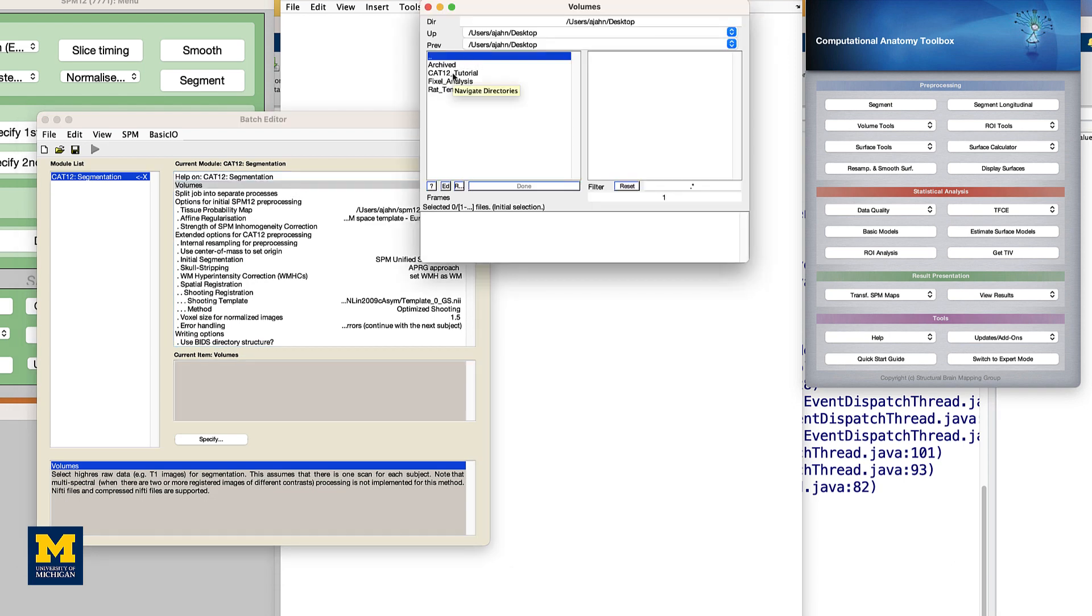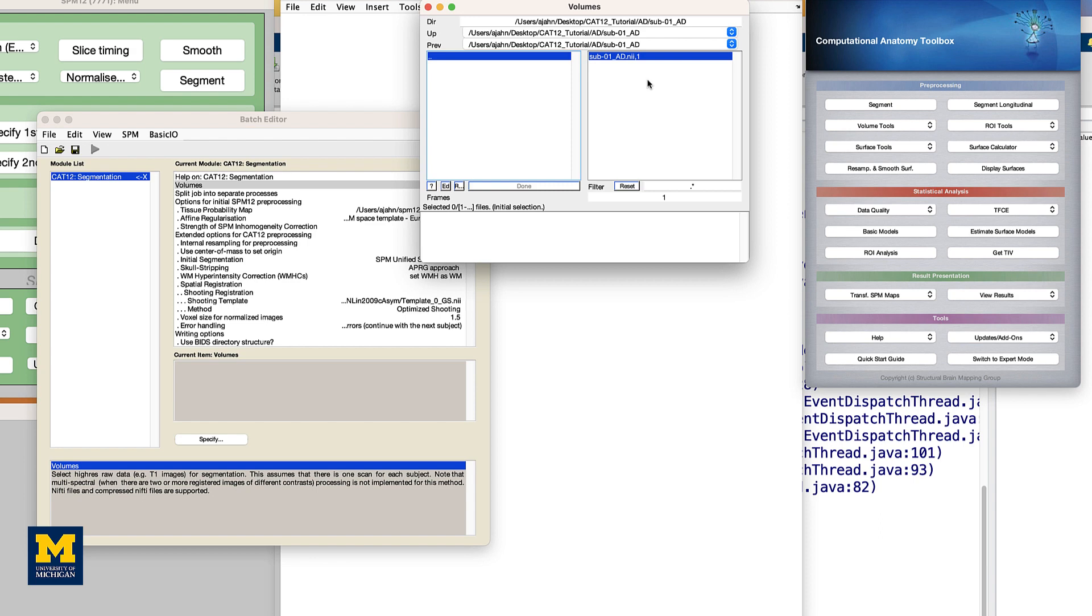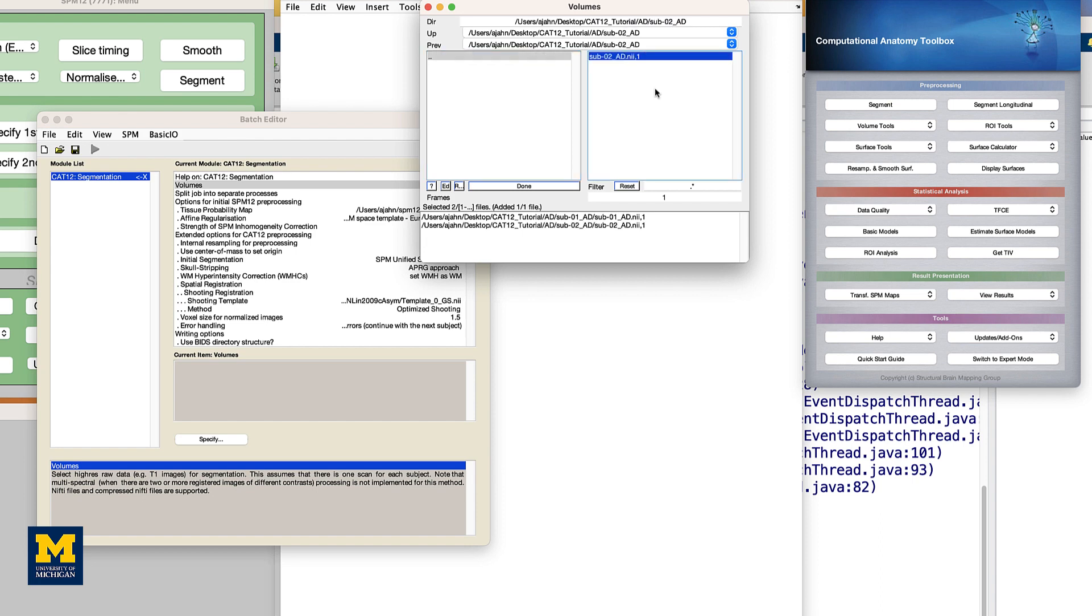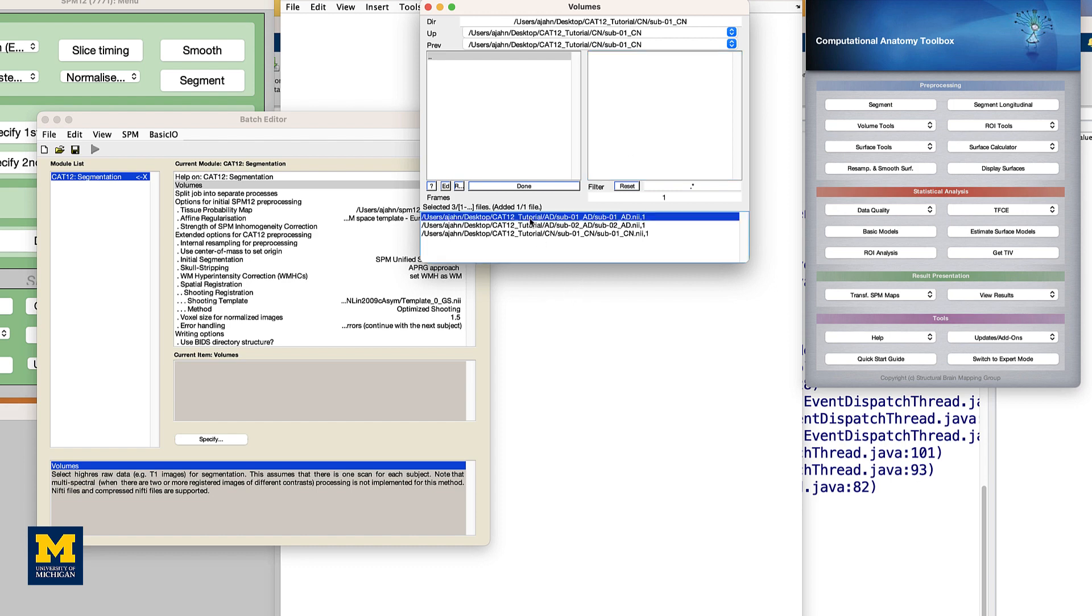Double-click on the volumes field and navigate to the CAT12 tutorial directory on your desktop. Go to the AD directory and select each subject's anatomical image, going in the order that the subjects are listed in the GUI window. Now, we could do this for each subject, but there's a quicker way to do it using the filter field.